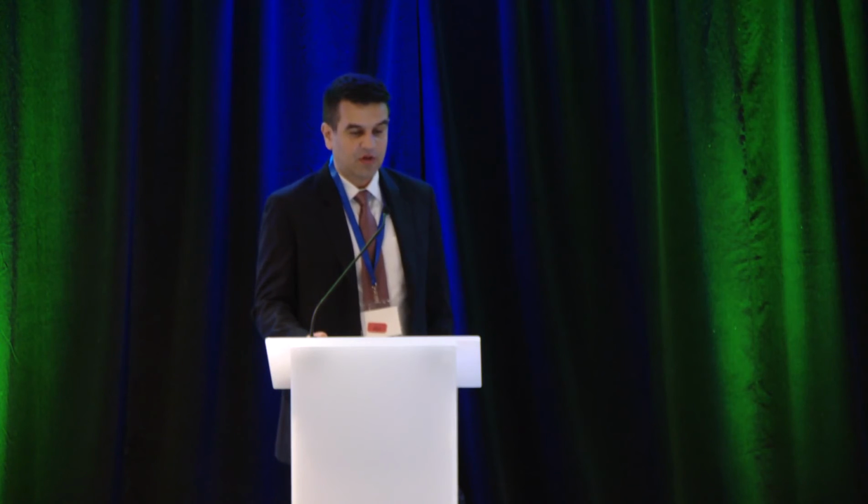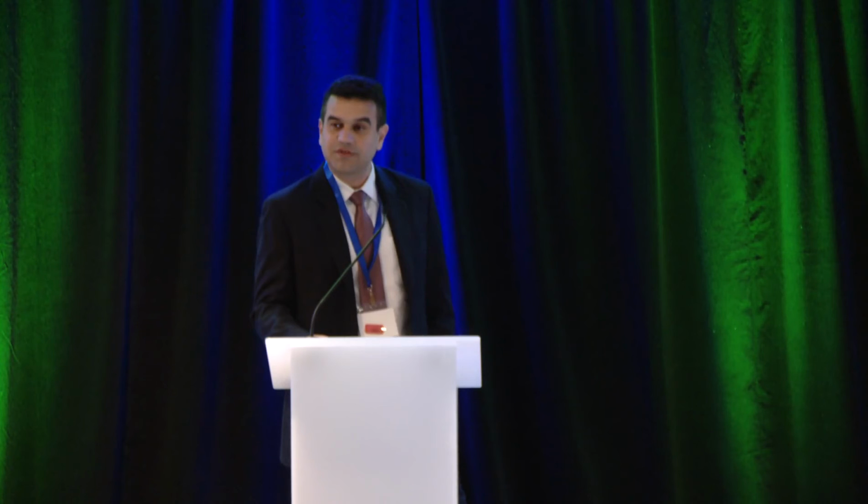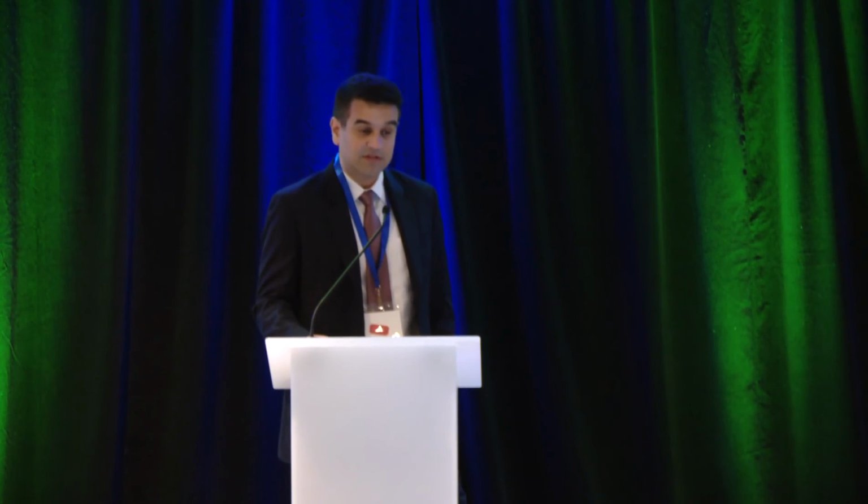And then moving along to hypercontractile esophagus. So hypercontractile swallows you heard about. So how do you make a diagnosis of clinically relevant, conclusive hypercontractile esophagus? You have at least 20% of these hypercontractile supine contractions with at least a DCI of over 8,000. You have clinically relevant symptoms, the same ones, dysphagia and/or non-cardiac chest pain.